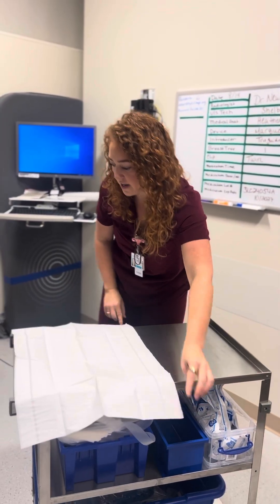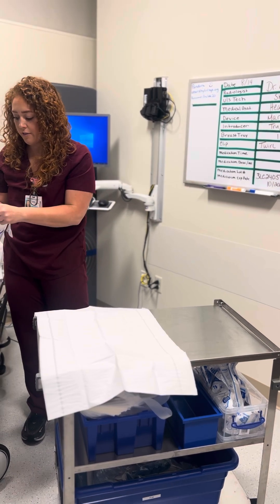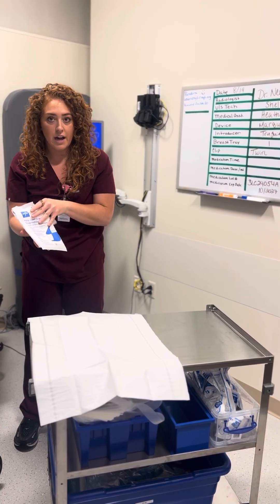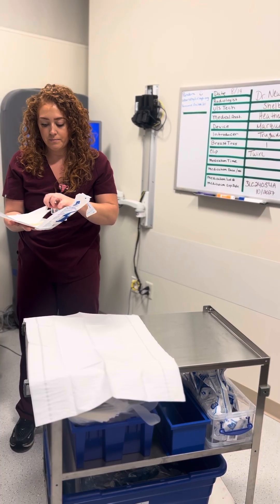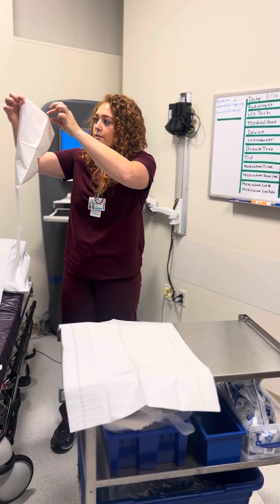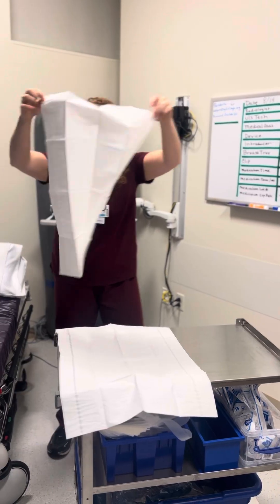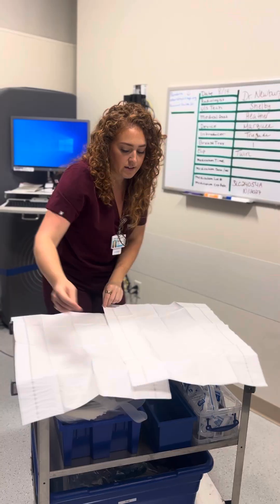We're going to lay them down. There are also different variations of supplies — for example, these drapes were at one point blue on one side and white on the other, so you would put the blue side down and white side up. I'm going to carefully open this up and lay that down.